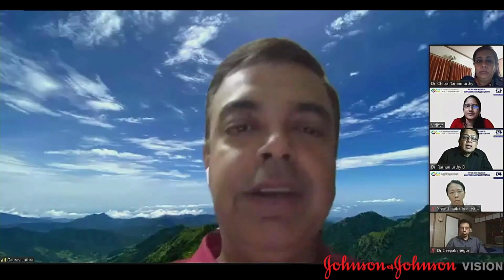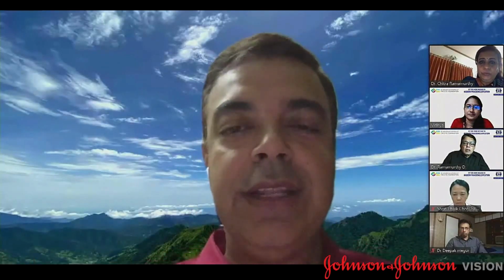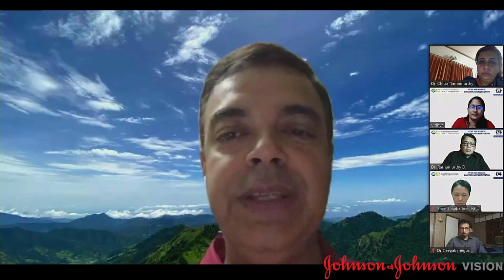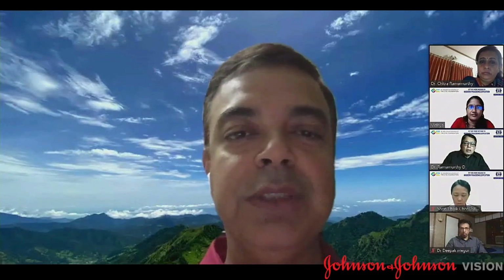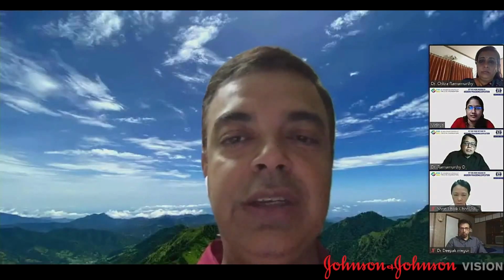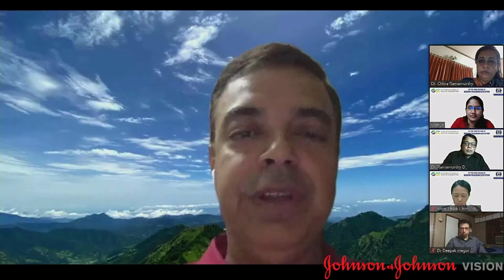Yes, in fact, she's covered all the points very nicely. The only thing is these lenses have to be customized, because even if you're thinking of a piggyback lens, sometimes it's difficult to actually have enough space. You have to see what the AC depth is, and the lens thickness obviously is much more. Customized lenses also have this disadvantage that they will not go in from any injector, because they're usually so thick that it'll be very difficult to get them in through any kind of injector.